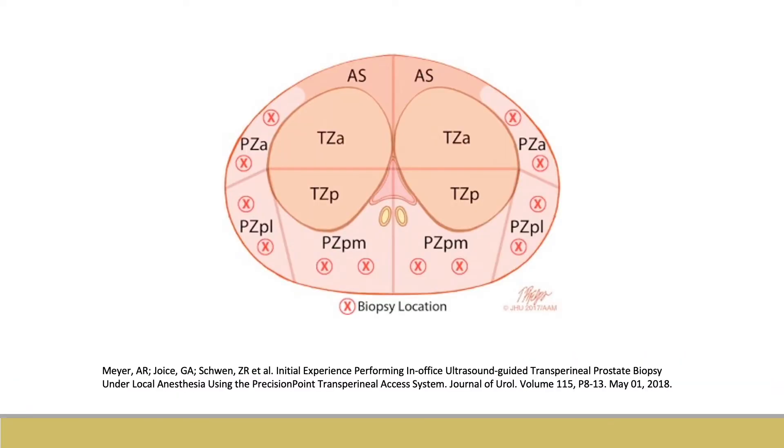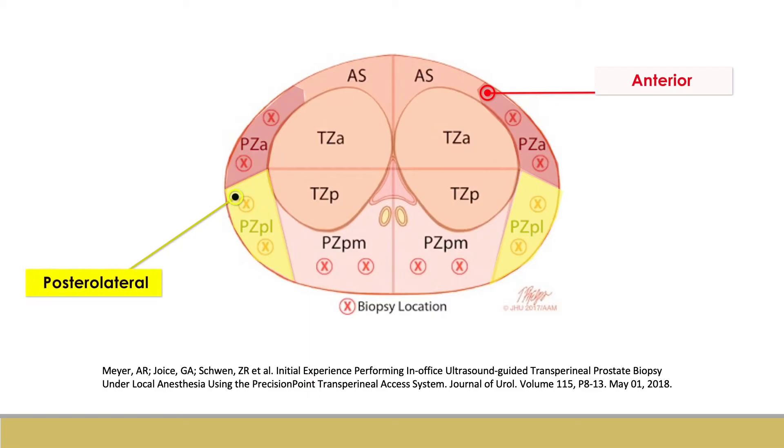We now begin collecting our cores. 12 total biopsies are performed, 6 on each side, with 2 anterior, 2 posterolateral, and 2 posteromedial biopsies taken. Additional cores can be taken from the transitional zones if there are prior negative biopsies or if the patient is in active surveillance.